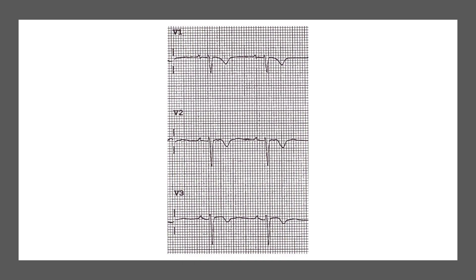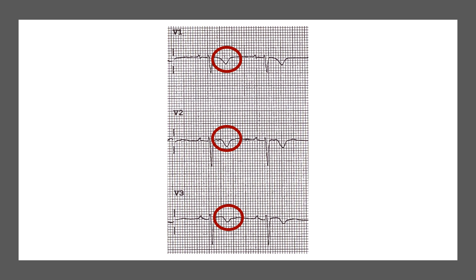Looking at V1 to V3, the first abnormality you'll notice is T-wave inversion. From previous discussions, we said there are two different shapes of T-wave inversions: asymmetrical and symmetrical. Asymmetrical T-wave inversions are abnormal but can be associated with relatively benign conditions like strain pattern or left ventricular hypertrophy. The symmetrical ones are the concerning ones — those are associated with PE, ACS, and serious conditions. Looking at our ECG, the T-wave inversion here is symmetrical.